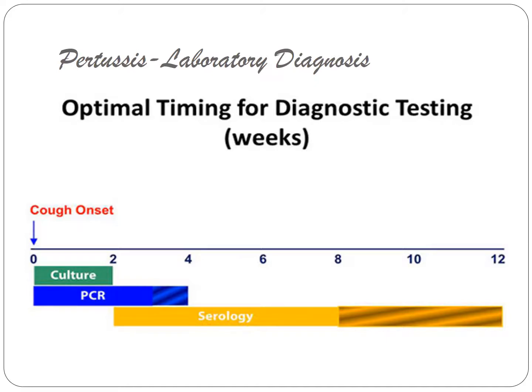Since culture has excellent specificity, it is particularly useful for confirming pertussis diagnosis when an outbreak is suspected. Many other respiratory pathogens have similar clinical symptoms to pertussis, and co-infections sometimes do occur. So obtaining isolates from culture allows for strain identification and antimicrobial resistance testing.